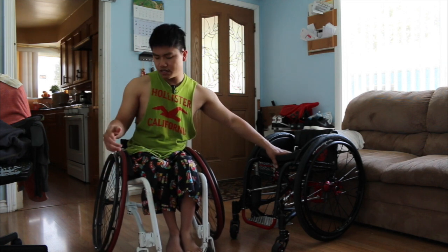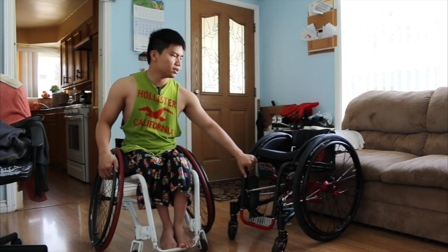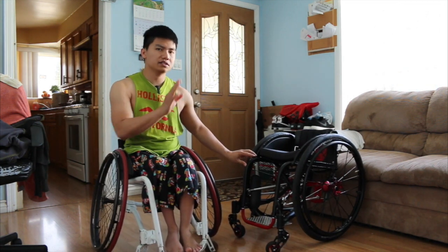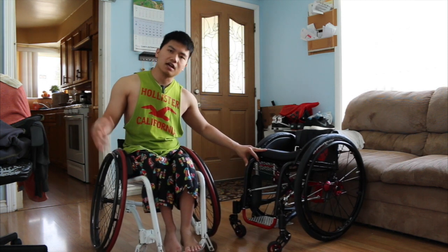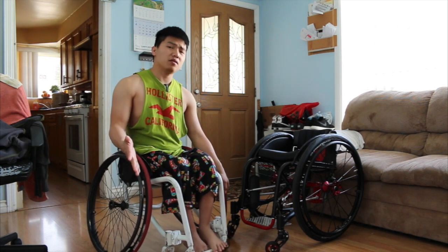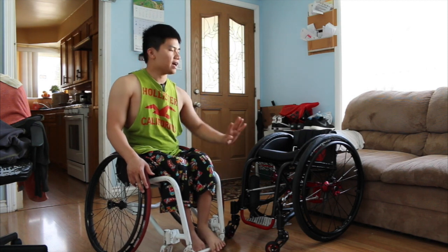Just to let you know, this is my first time doing it this way on camera. Usually I use my crutches, walk up, and then just sit on the other wheelchair. But I'm just gonna show you guys how to do that also.